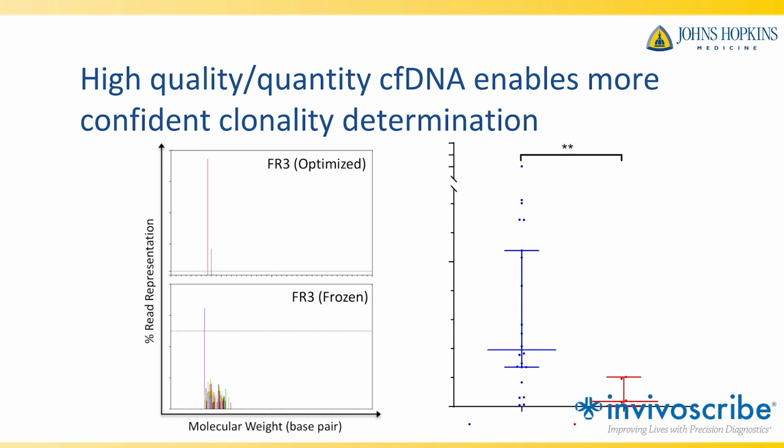So what we saw was, for example, if you look at our clonalities display, we actually do it in a combined molecular weight-based and sequence-based method.